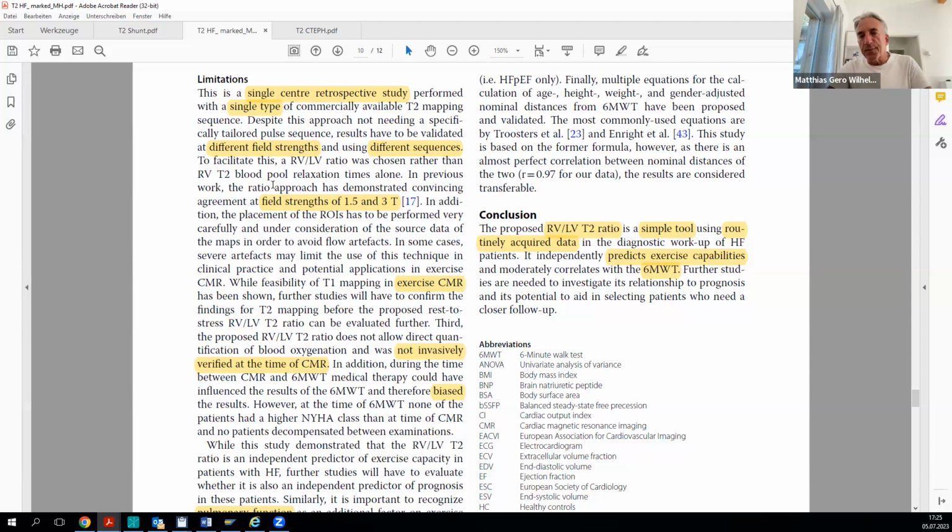Okay, there's a question from Ruud van Heeswijk. The used T2 preps were originally chosen for measuring myocardial T2s in the order of 30 to 60 milliseconds, but you measure T2s up to 150. So with some uncertainty at that level, do you expect to increase your sensitivity if you would sensitize the sequence to higher T2 values?